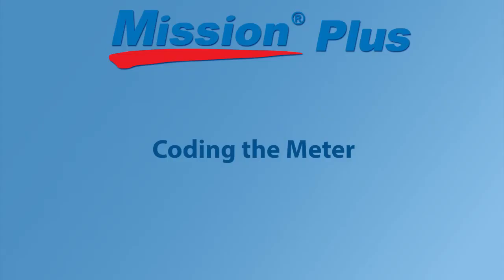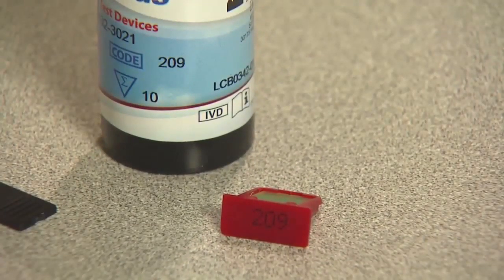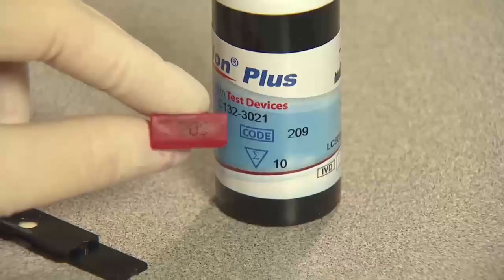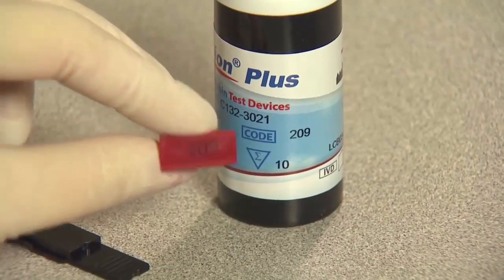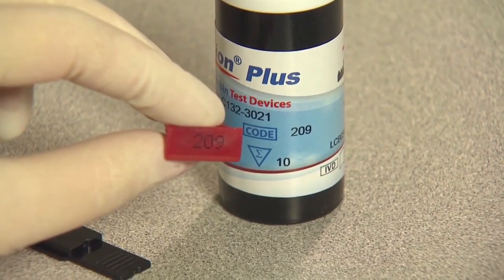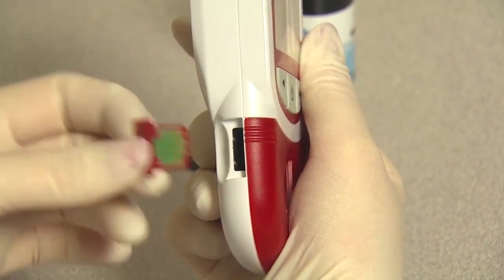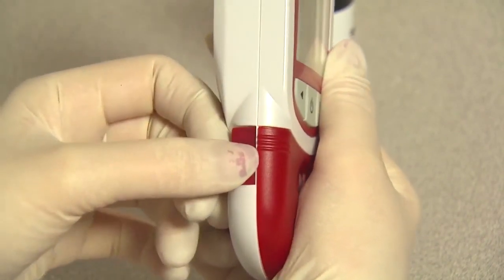Coding the meter. Each time a new box of test devices or test strips is used, the new code chip included in the box must be inserted into the meter. Compare the code number on the code chip from the box with the code number printed on the test devices or test strips canister. It is important to do so because results may be inaccurate if the two numbers are not identical. Insert the correct code chip into the code chip slot of the meter.